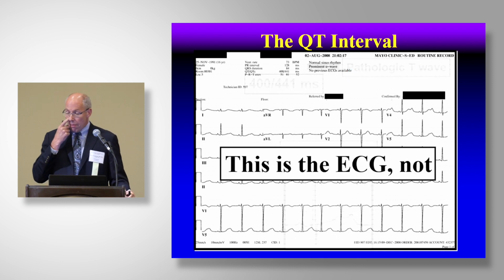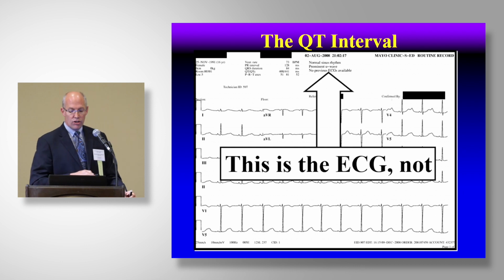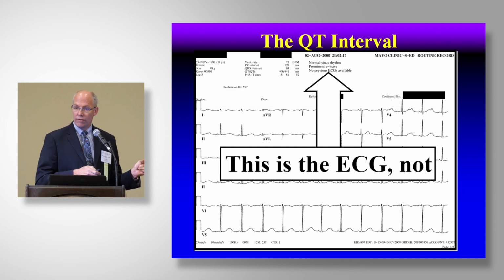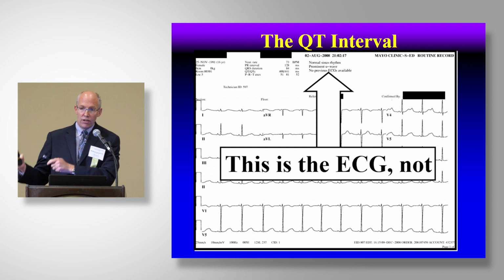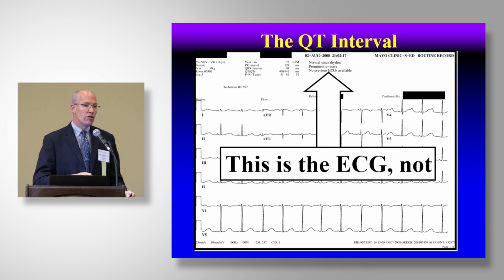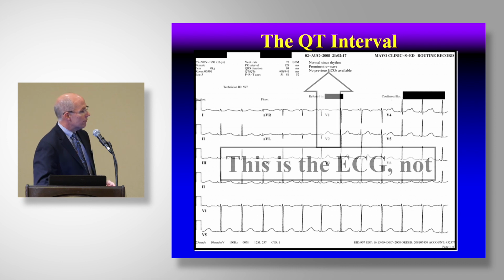And so it's a reminder that we always have to come back to this: the ECG, not the report. So if we're ever going to order an ECG for screening, for sudden death predisposing conditions, or because the story drove us to get an ECG, we have to adjudicate the computer's QTc. Otherwise, you'll be vulnerable.